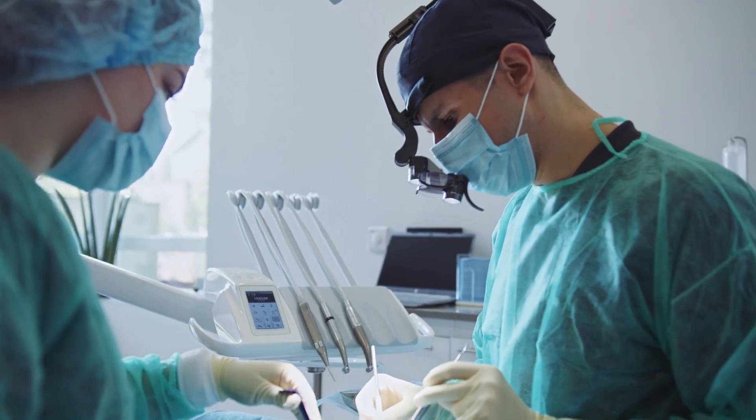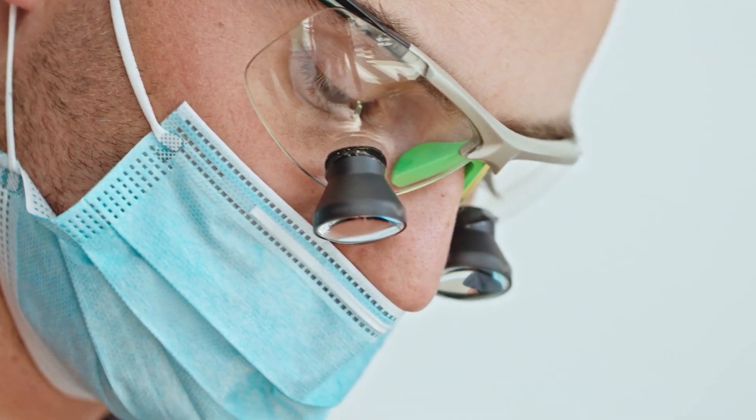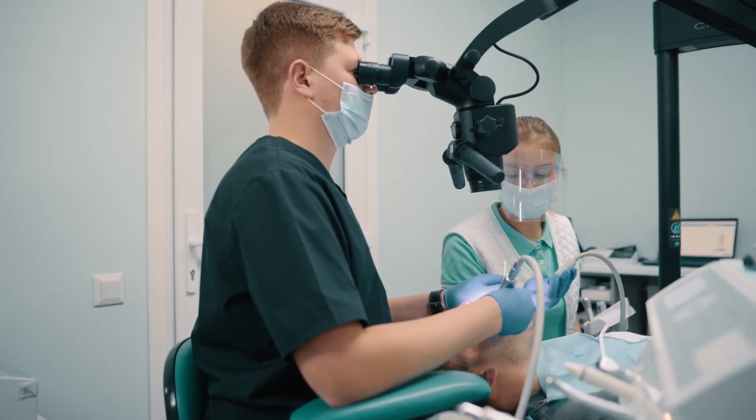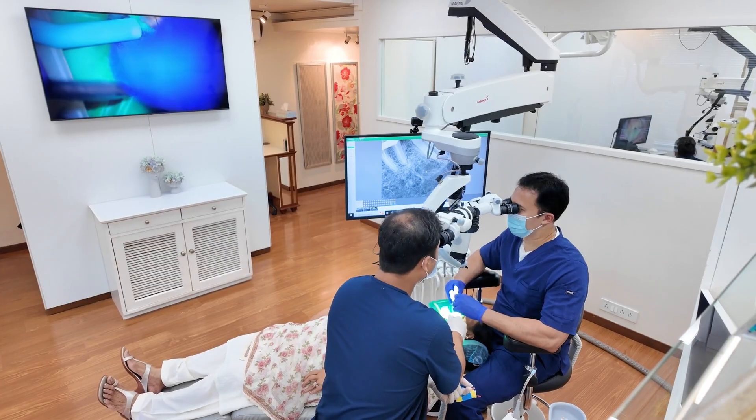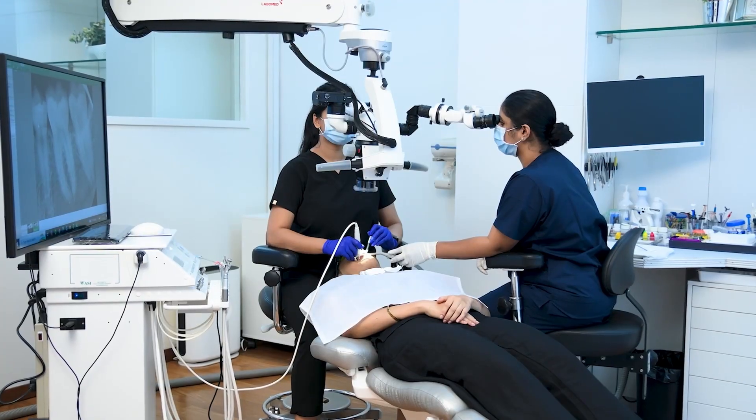The major advantage when comparing loops to microscopes isn't just in the procedures — I think the main difference is differentiation. Virtually every clinician these days is using a loop, whereas the number of general dental practices using a surgical microscope for everyday dentistry is probably less than 1%. If you bring a microscope into your general dentistry practice, it immediately puts you way ahead of 99.9% of practices out there. The ability to differentiate yourself in a very crowded market alone should be worth the time, effort, and money of incorporating a surgical microscope into your practice.